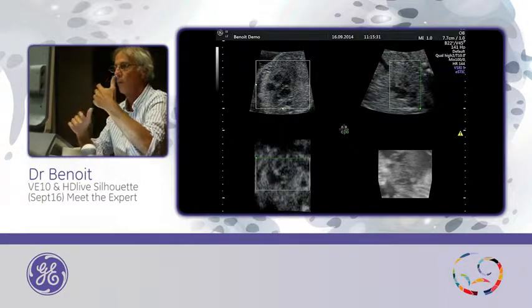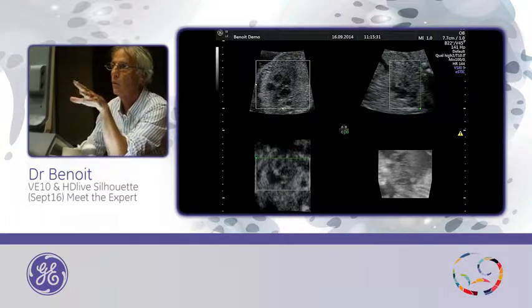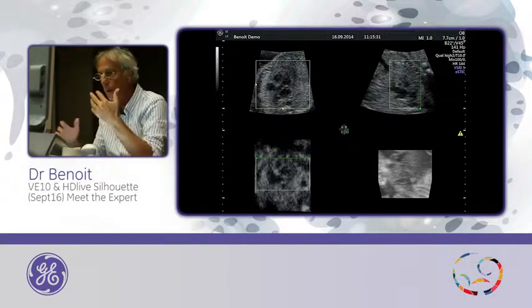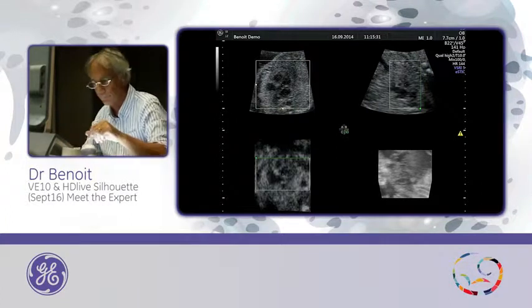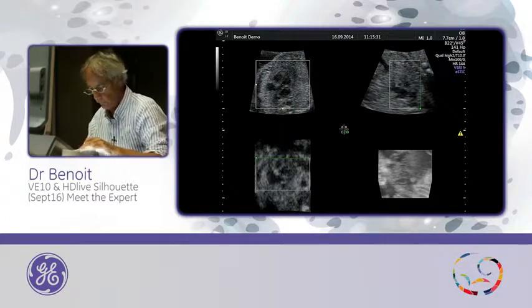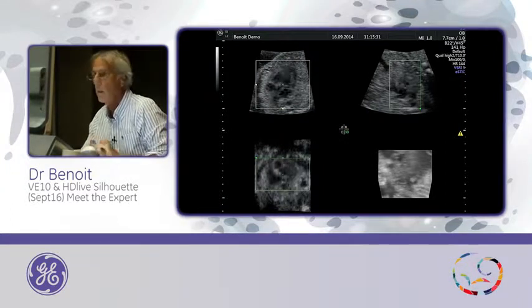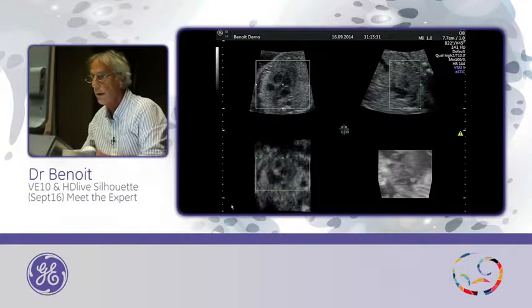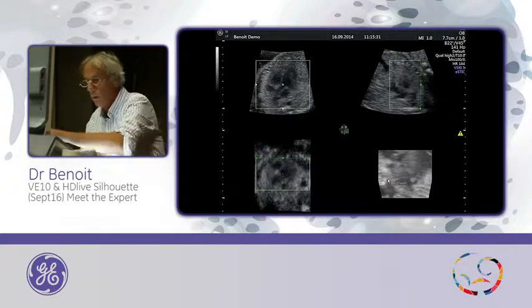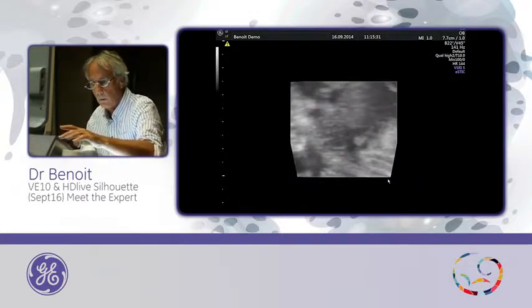Okay, so the last one, maybe you saw in my lecture a heart with the view from the back, and it was this case, and I will try to reproduce it because sometimes you do some nice picture, it's difficult to do it again. So this is a STIC. I start. And this is a result with a gray here.